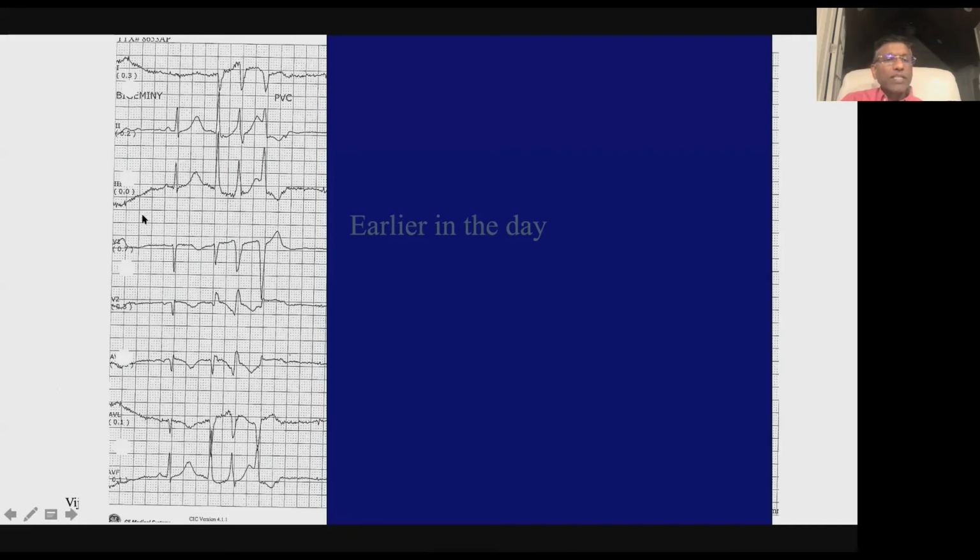Yeah, can we take a look at this? Remember this lady, a 50-year-old who came in, a depressed 50-year-old with vomiting, kind of a bad GI, just dehydrated, and she was throwing all these arrhythmias. So we were called to see what's going on. Reba, would you like to take this?